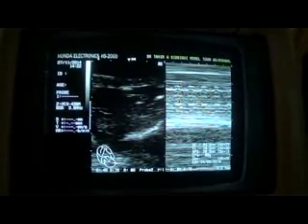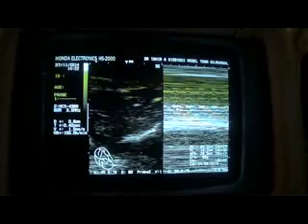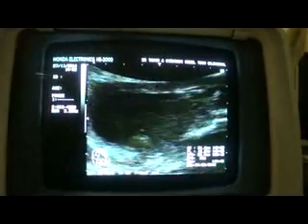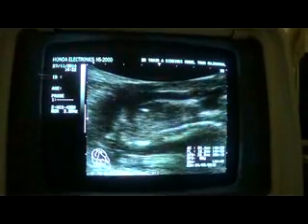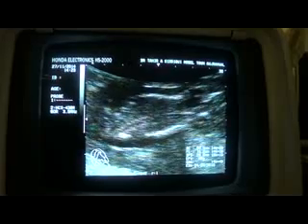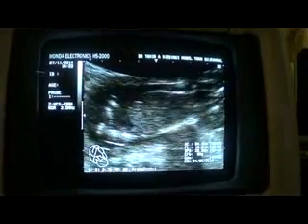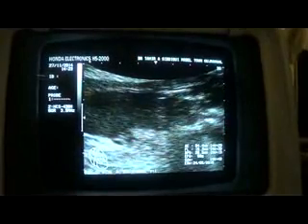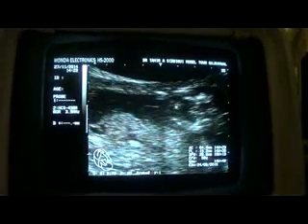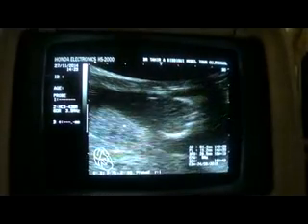And the fetal heart rate at the time of ultrasound is about 150 beats per minute with a regular waveform. Moving ahead, the chest of the fetus is of normal size, and we have seen there is cardiac pathology. You can see the echogenic particles were flapping with the movement of the valve. And this is the heart.